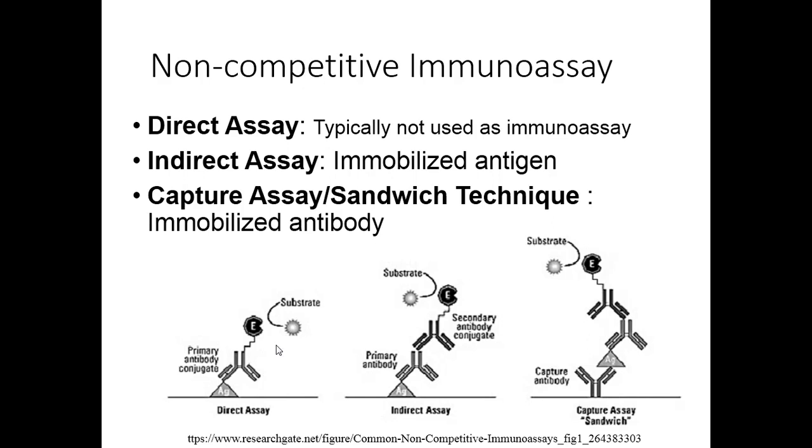This illustration shows three pretty basic variations of non-competitive immunoassays. You're going to find a lot of variations on this theme, and in fact, the book shows different variants of this. It all depends on how the test method was designed. I'm using this right now, not because it's following right along with the book, but because I really liked the illustration of these reactions. I thought they were a nice illustration for us to follow along with.